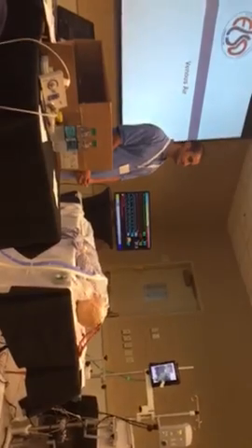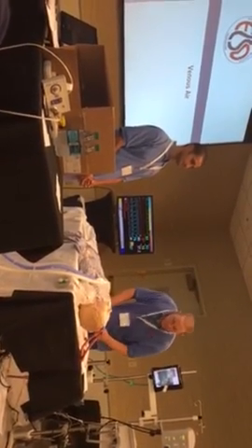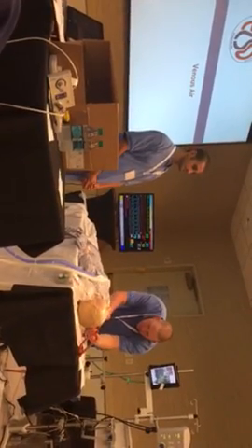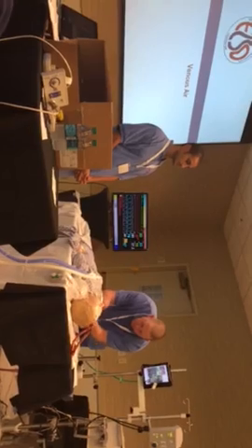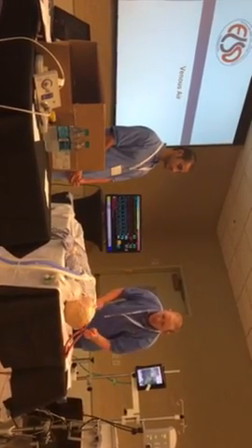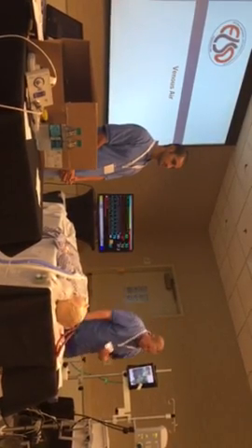Yeah, and it's just troubleshooting, right? Initially everything was good and the catheter moved. Didn't notice how much initially, right? And so it's continuing to think of internal reasons, non-catheter related, as to where the source of the error was. And I, anatomically, really couldn't come up with one unless catastrophe had happened. But that was my slowness.